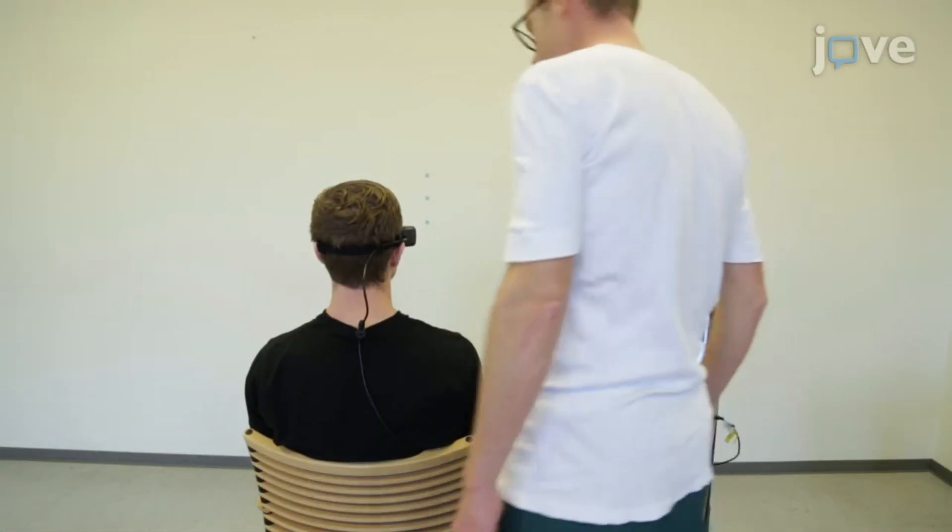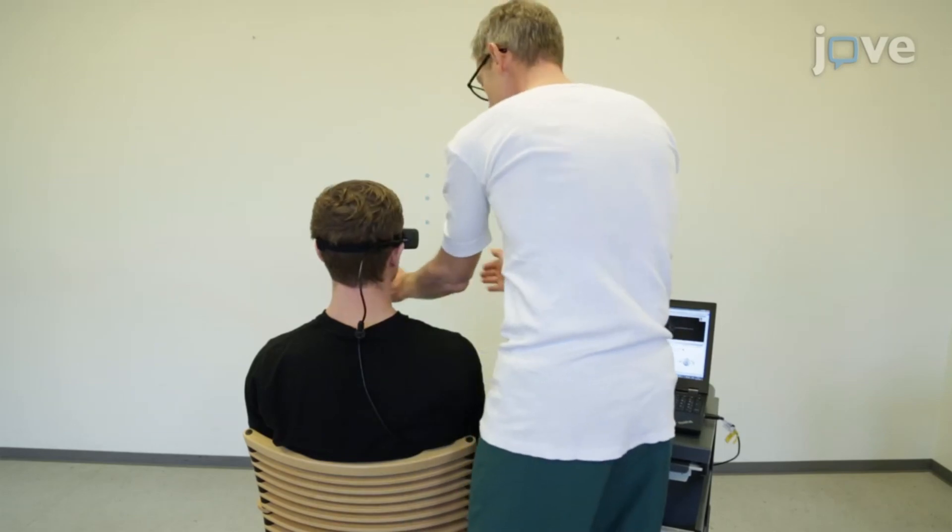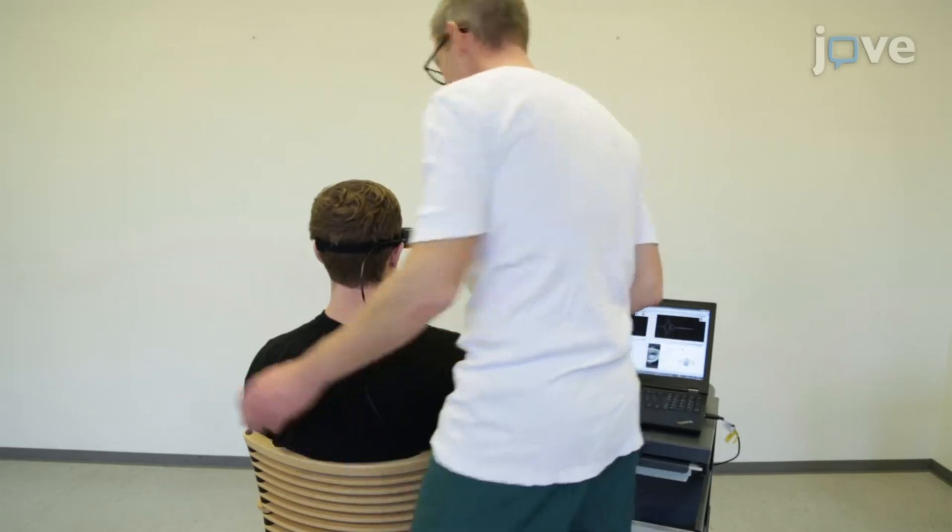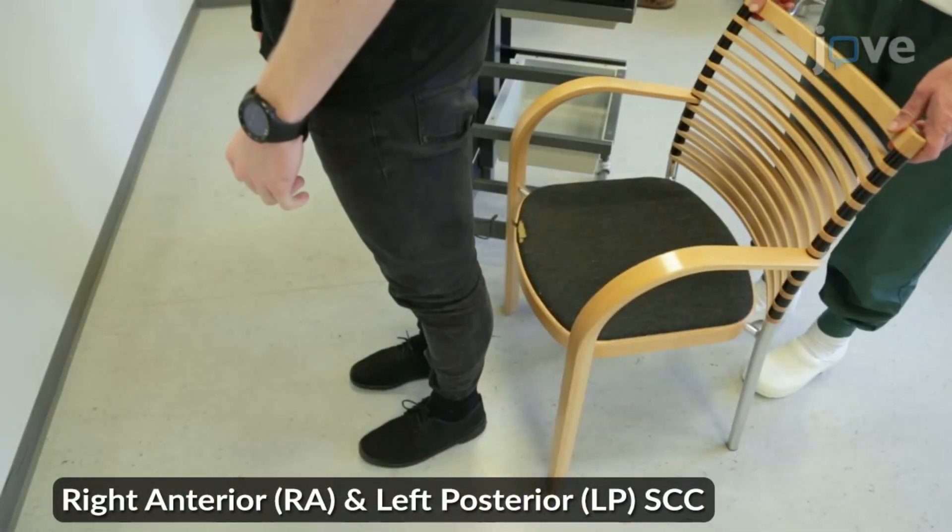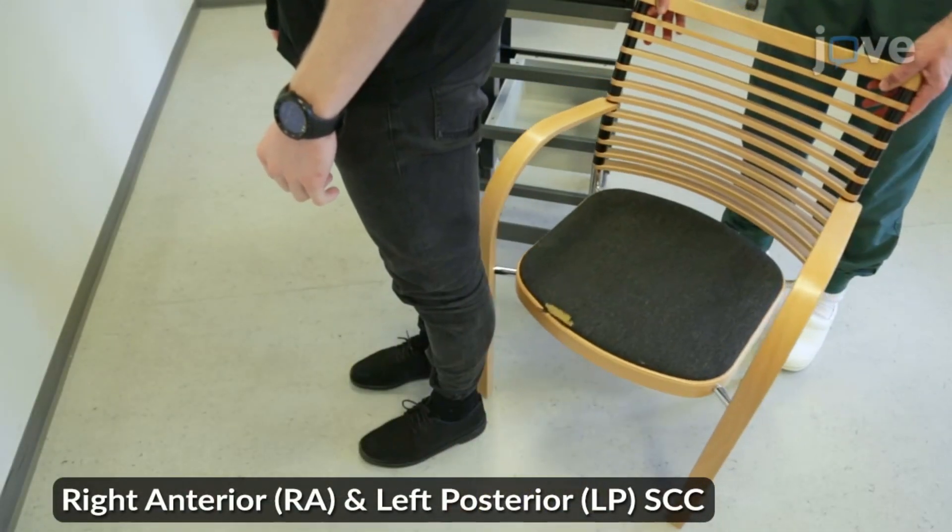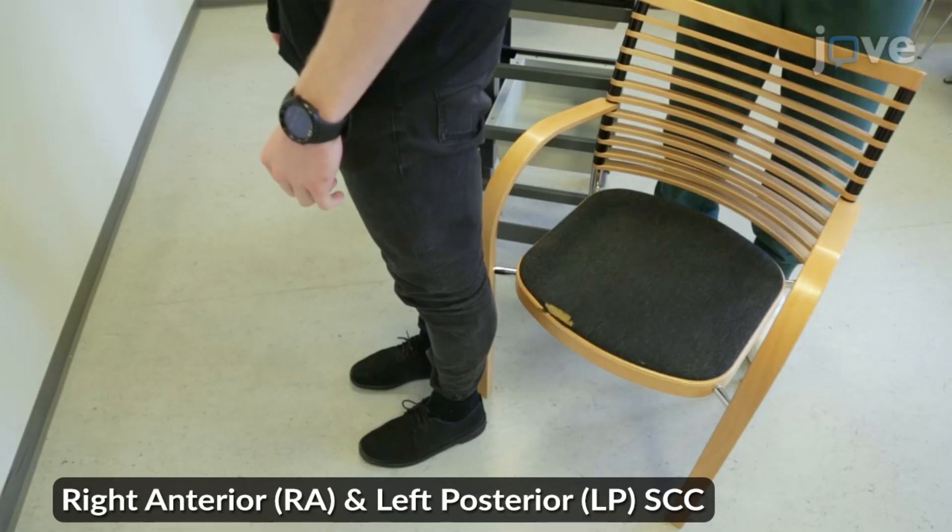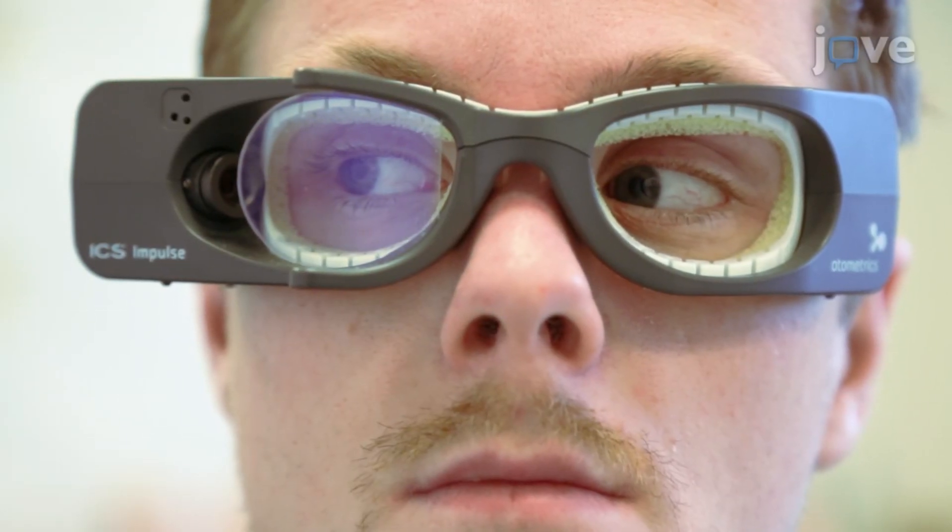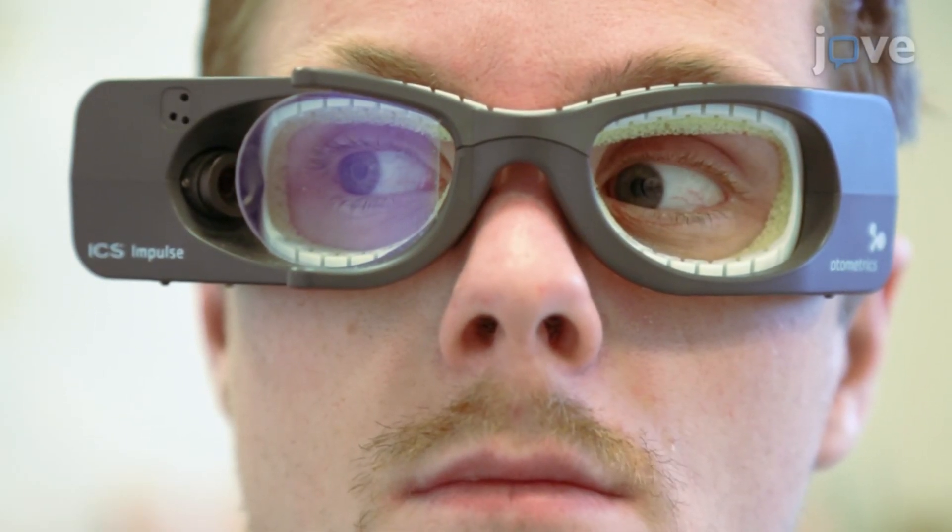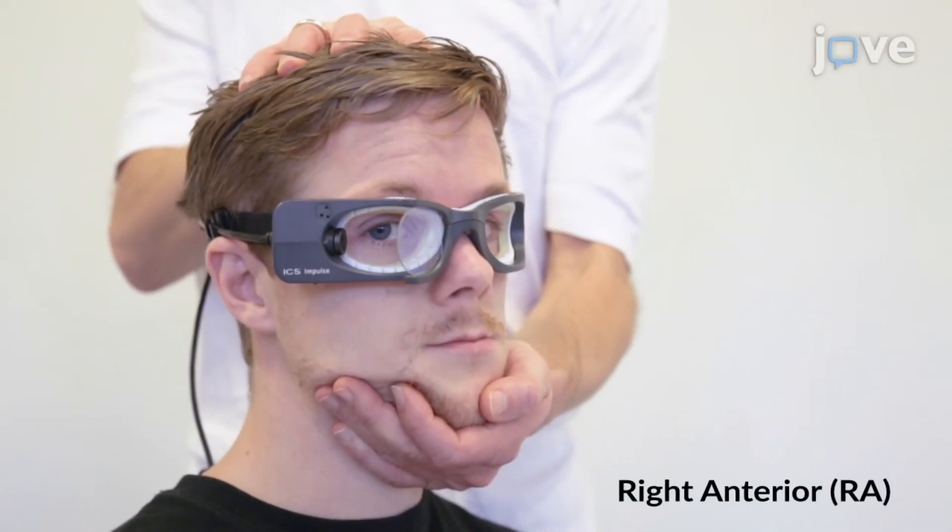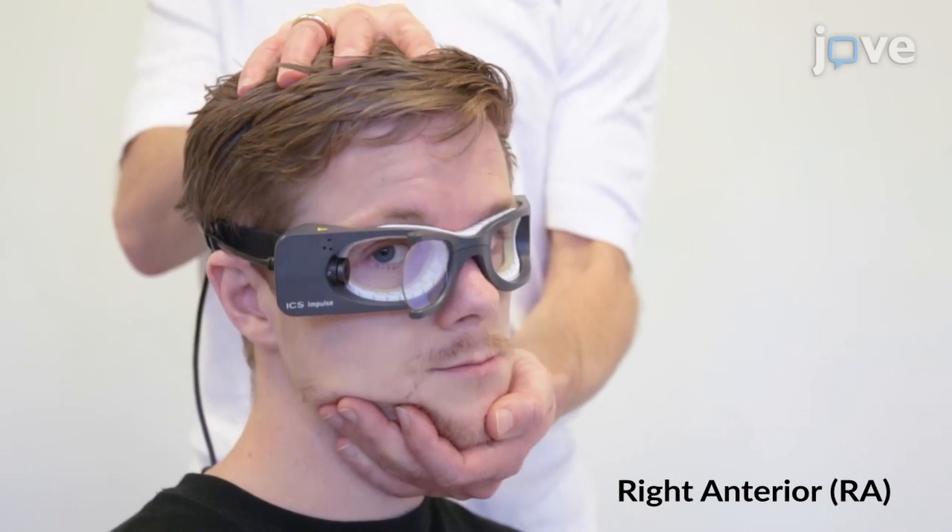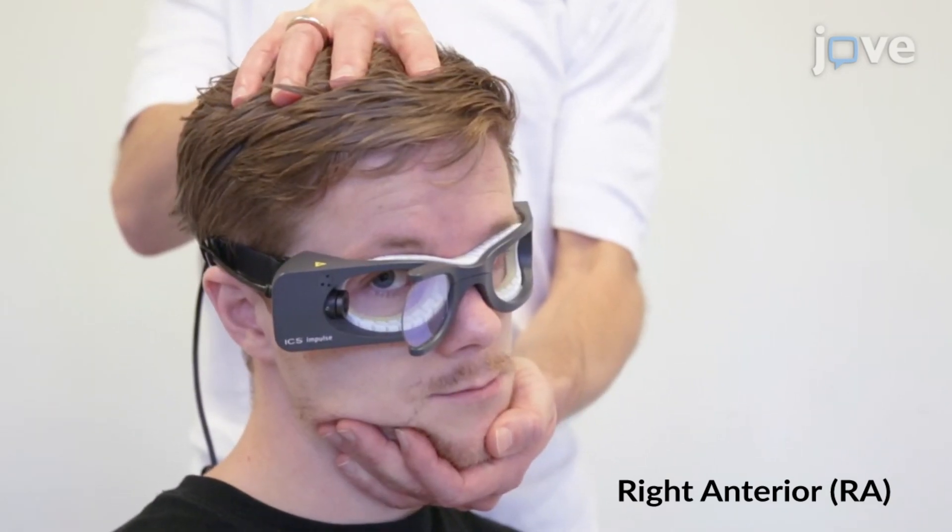Then use the 2D VHIT test method with System B by rotating the chair 45 degrees to either side. Turn the solid chair 45 degrees to the left, and ask the participant to look at the fixation dot. Then, for anterior SCC testing, rotate the participant's head forward in the pitch plane perpendicular to the wall.